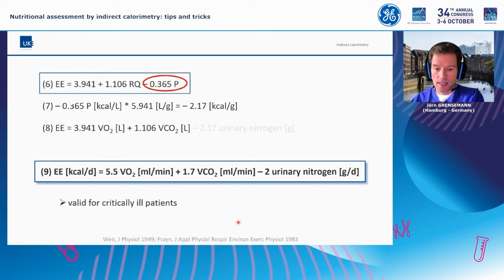And later on, Frayne in '83 could show that this is even valid for the metabolism of critically ill patients, down to a molecular level in lactic acidosis and so on. It's still valid, this formula.